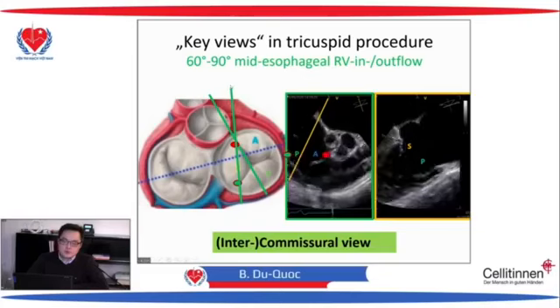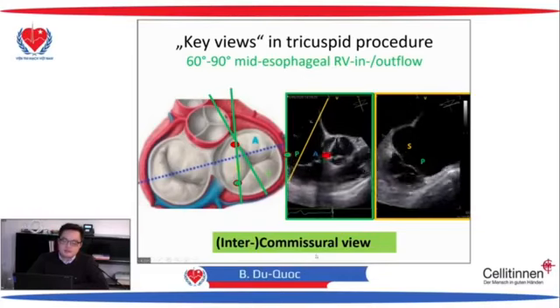Yes, and if you rotate your plane into these two commissures, you have the intercommissural view.